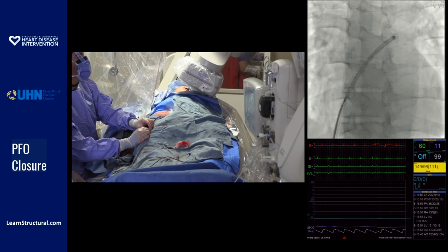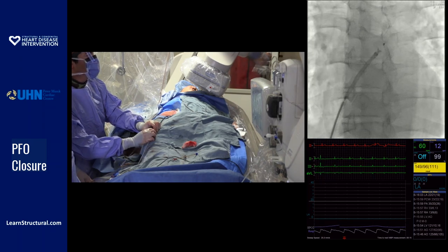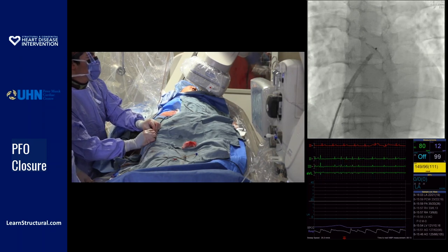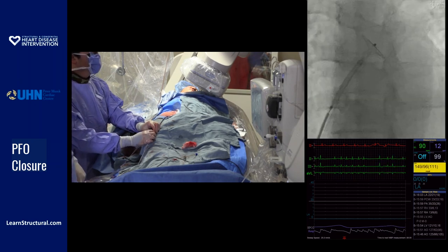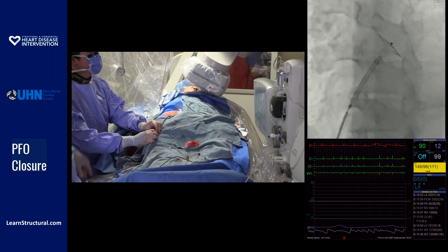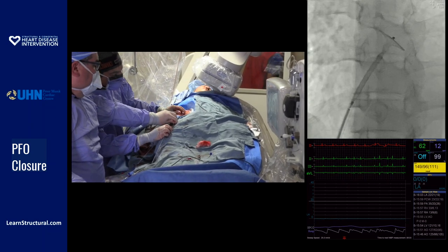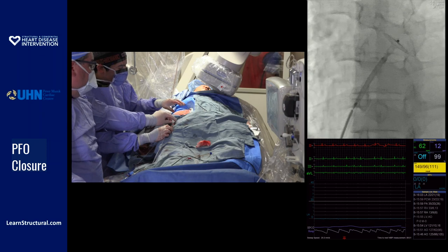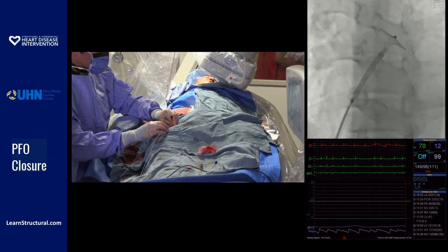I like your hands close together at the tip of the sheath. Open a little more — perfect. So now what we're going to do is pinch the sheath right here. Pinch the sheath here — okay, the blue part. Pinch hard. Pull back the sheath and the cable together.